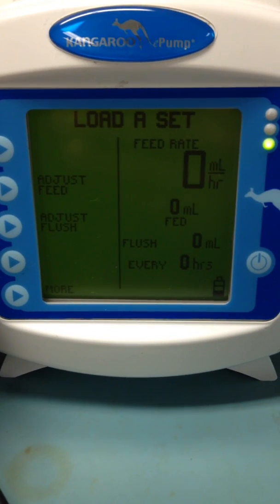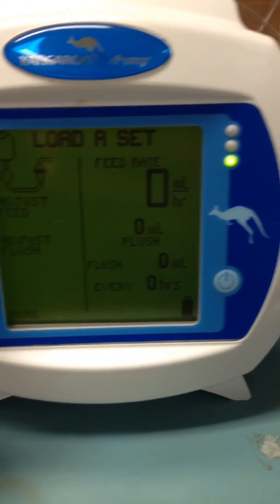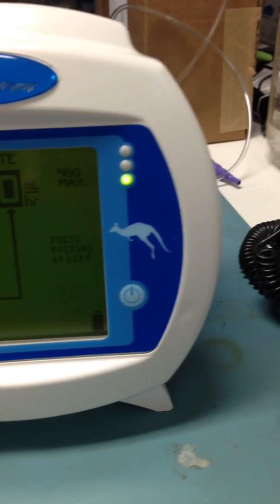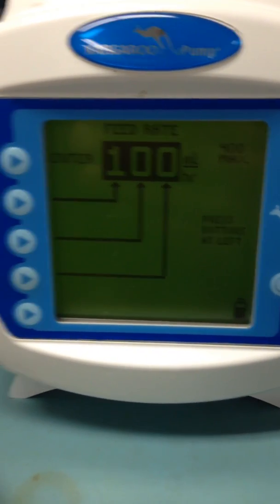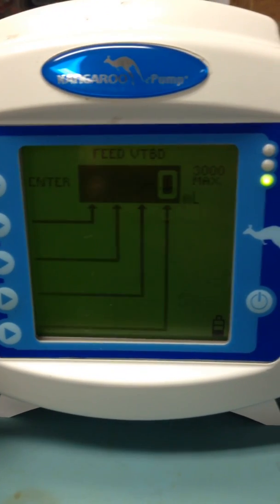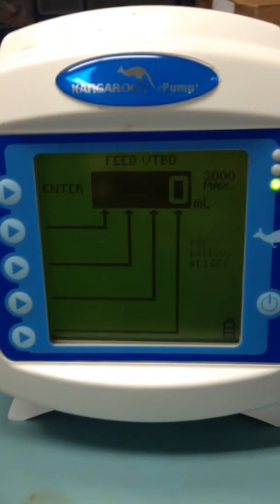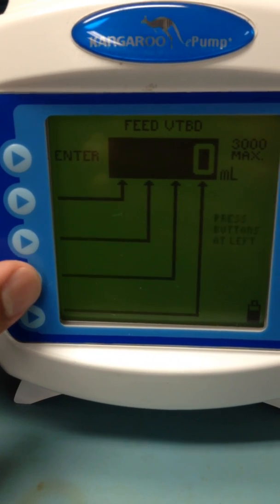It says: load a set, adjust feed, adjust flush — we're going to select adjust feed. We want to change the feed rate; we usually do 100 milliliters. Then for feed volume, this is how many milliliters we're going to test to see how much comes out — we're going to set it to 40.